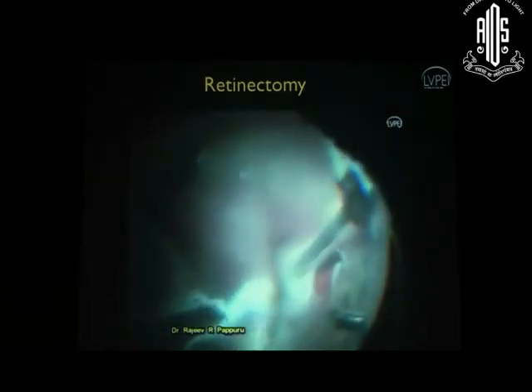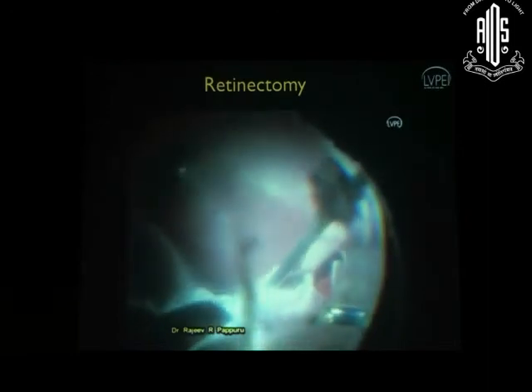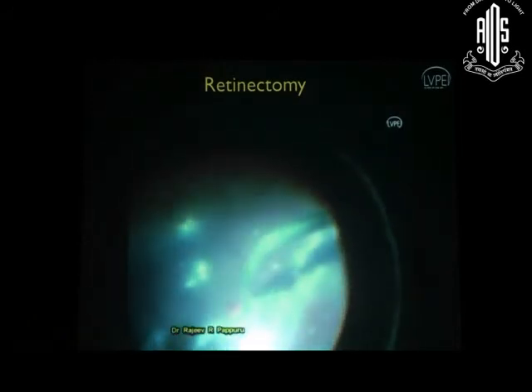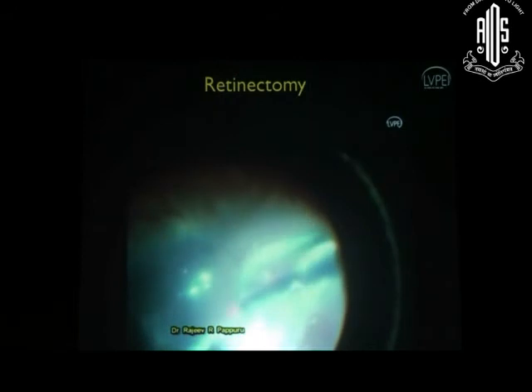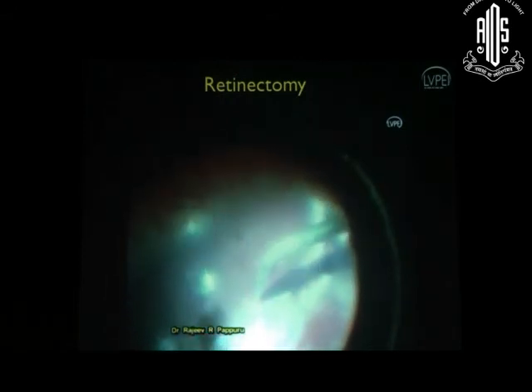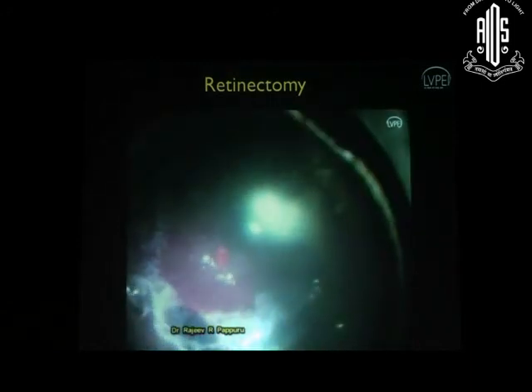And make sure that the bleeding points are always taken care of, so that blood will not go into the subretinal space and cause a problem there. If you leave blood in the subretinal space, it can form subretinal membranes again, causing the PVR to recur and the retina to redetach again. So you can see that the retinal fold has disappeared after you cut the retina there.